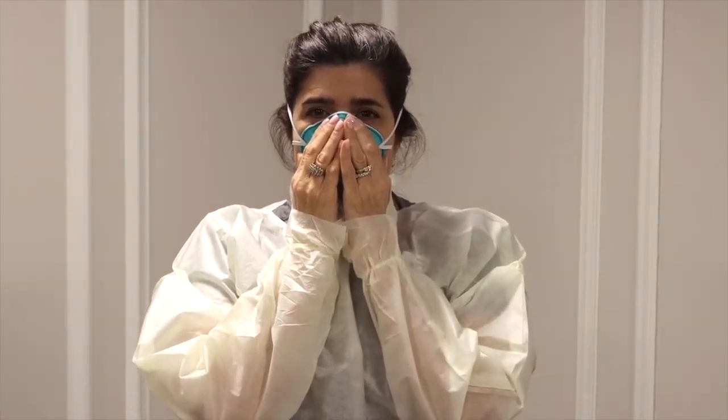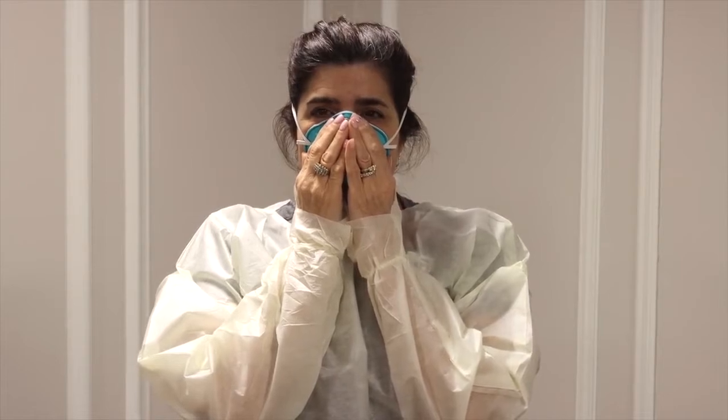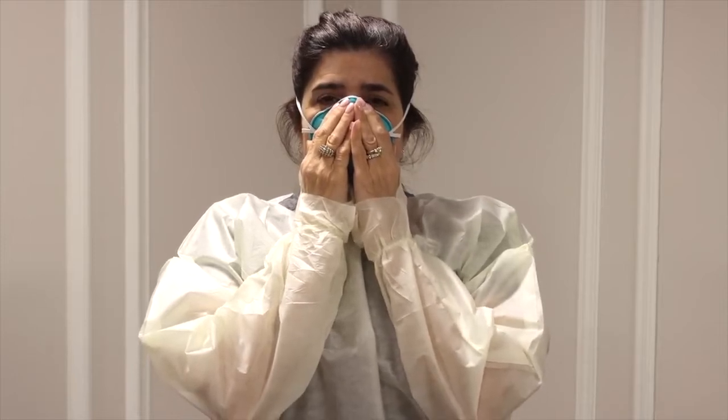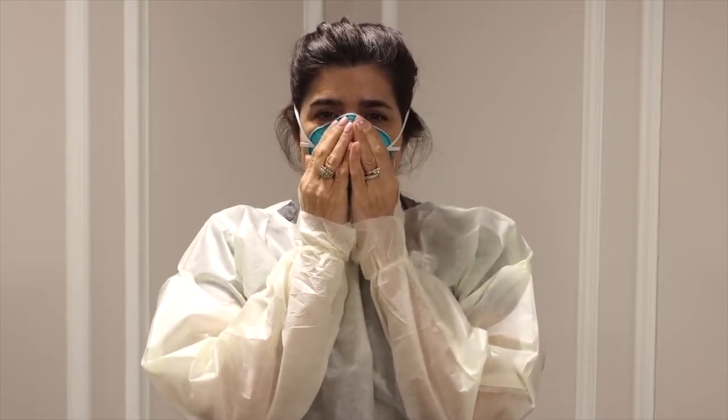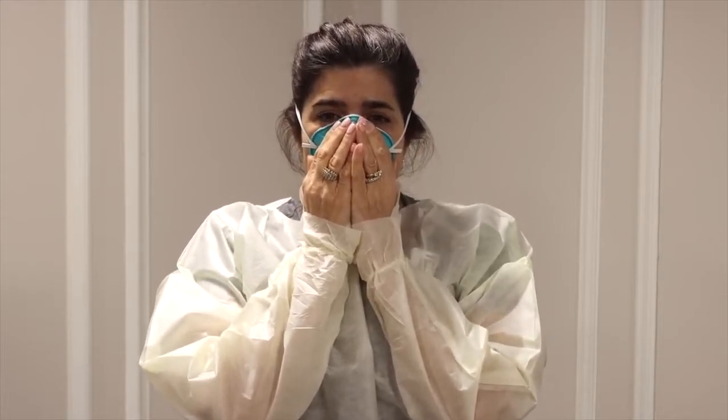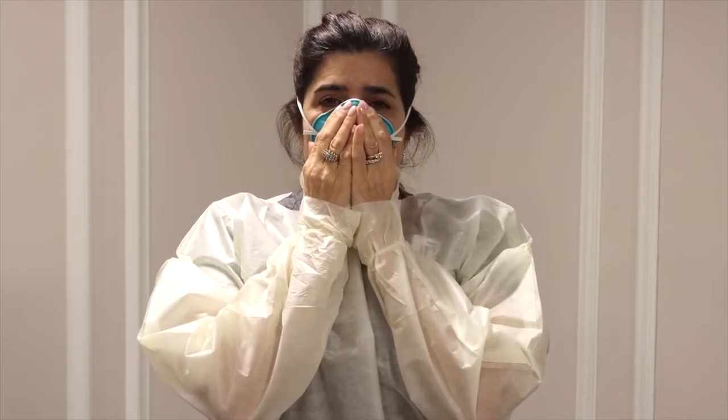During a negative pressure user seal check, the respirator user inhales sharply while blocking the paths for air to enter the face piece. A successful check is when the face piece collapses slightly under the negative pressure that is created with this procedure.